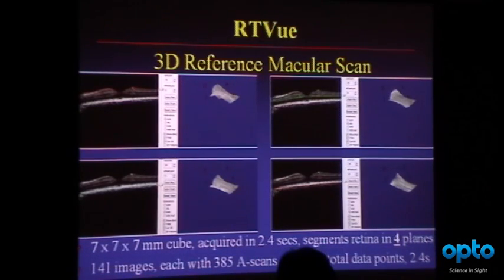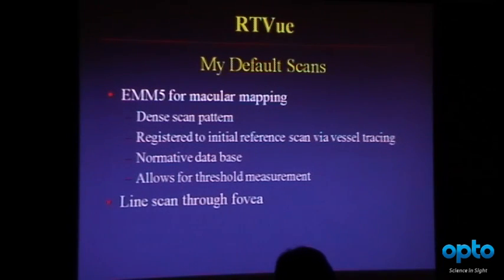And you can get the four different layer maps in this scan as well.